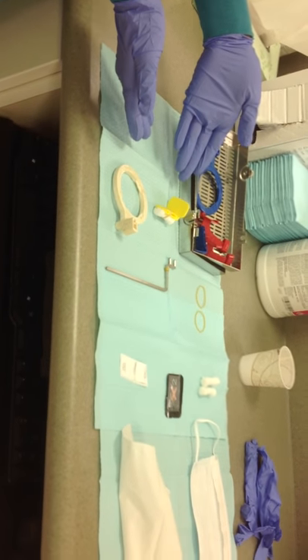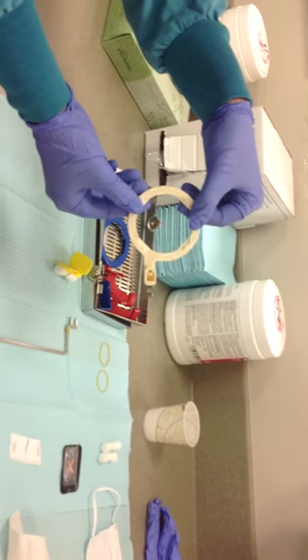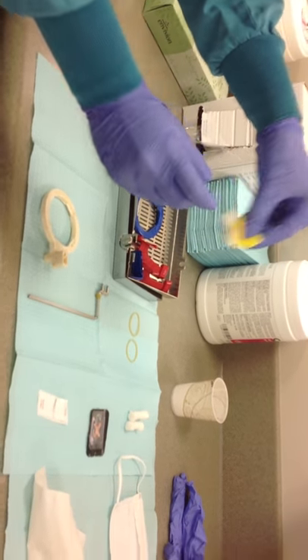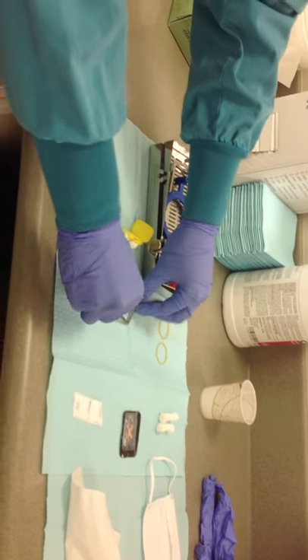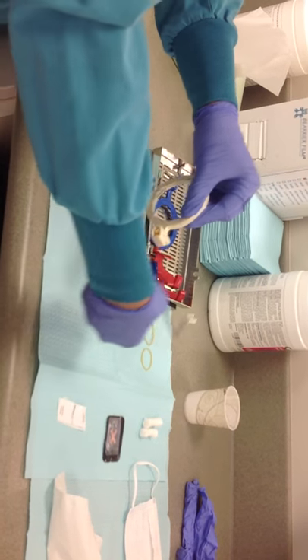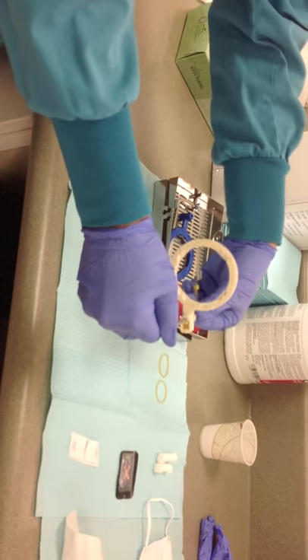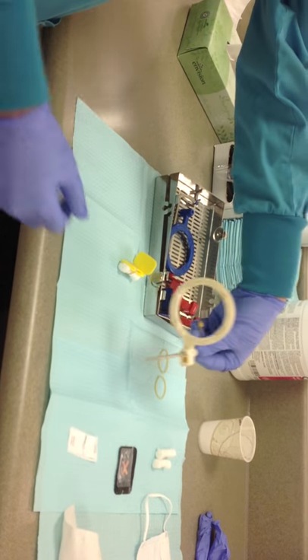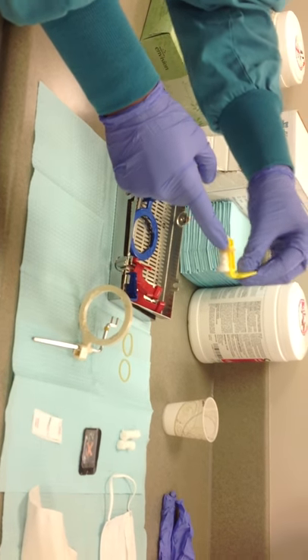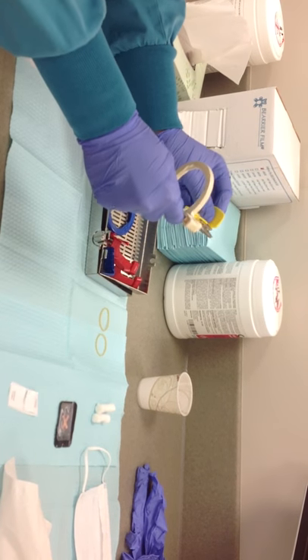To set up the XCP, choose the white collimator ring that is off-center, the correct bite block for the procedure, and the metal bar that corresponds with the ring. First, slide the collimator onto the metal bar, making sure the notches are facing the operator. On the bite block, place a cotton roll on the biting surface of the opposite arch, securing it with the rubber band. This helps stabilize the bite block. Slide the bite block onto the metal rod so it is centered in the circle.